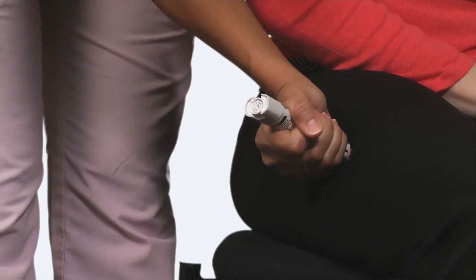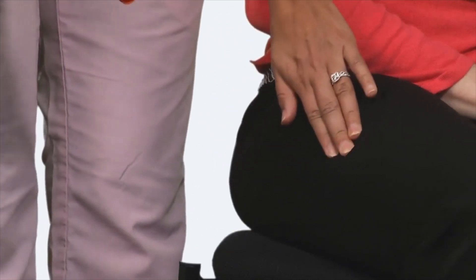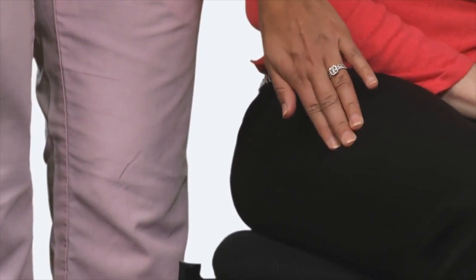The needle is designed to go through clothing, including jeans. Hold firmly in place for three seconds — count slowly: one, two, three. Remove the auto-injector from the thigh and massage the injection area for 10 seconds. Get emergency help.